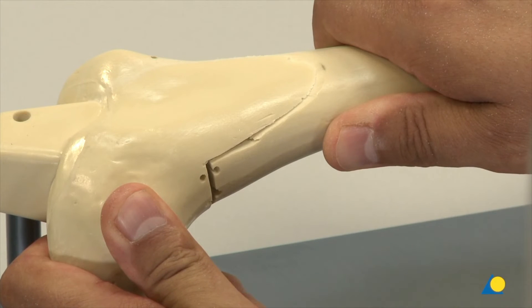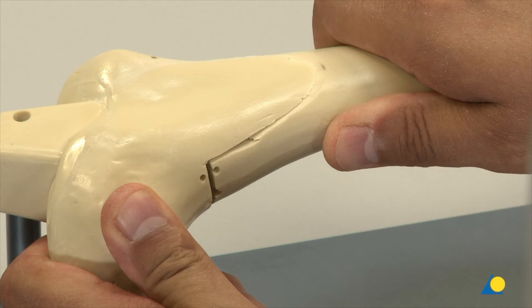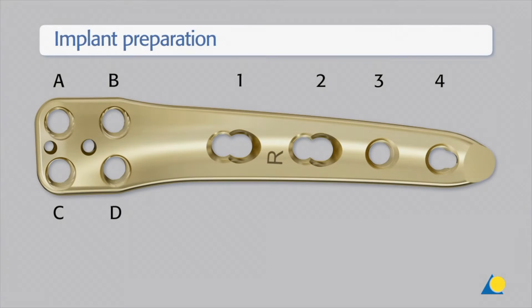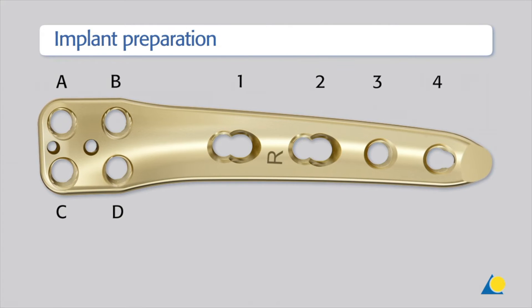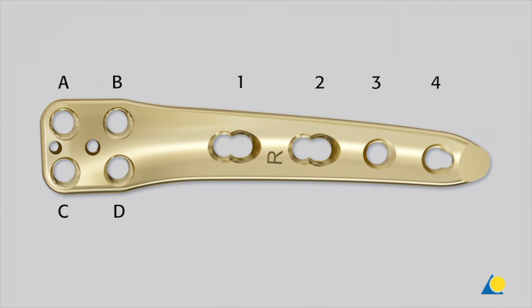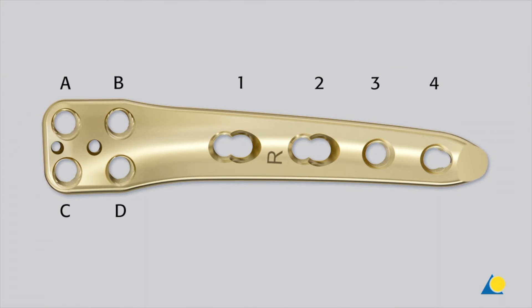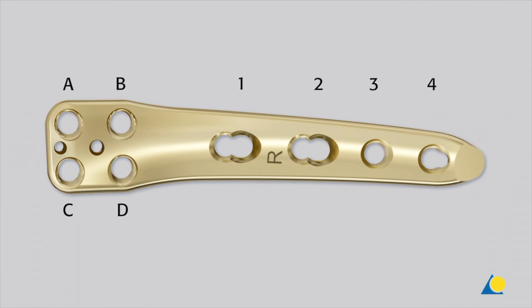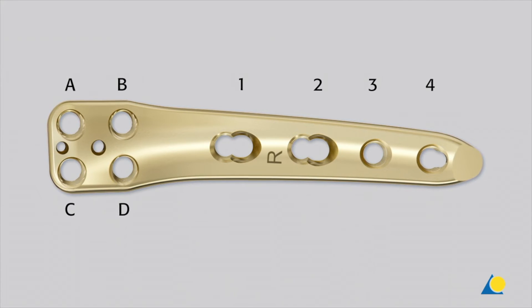The osteotomy gap can be held closed either by manual compression or with two crossed K-wires positioned so as not to interfere with the intended position of the plate. To allow uniform orientation, the four distal plate holes are labeled A through D, and the four proximal combination holes are labeled 1 through 4, from distal to proximal.